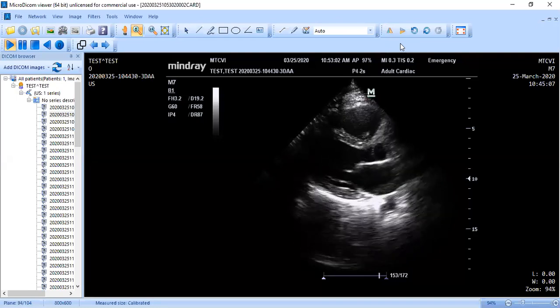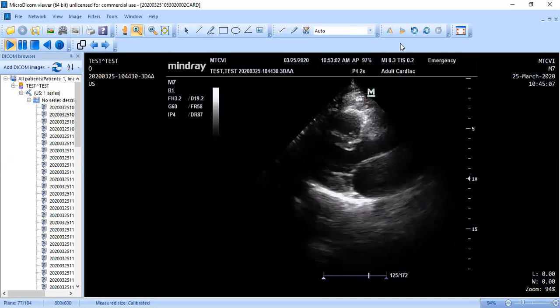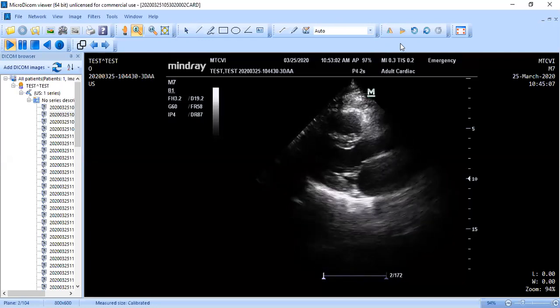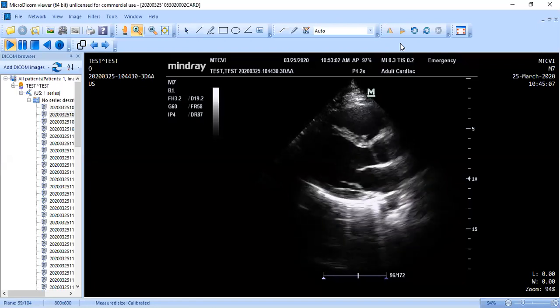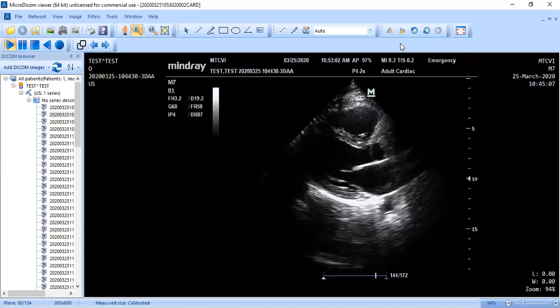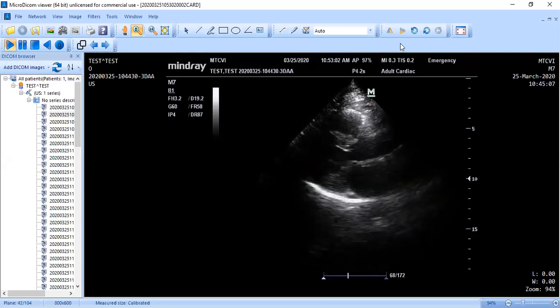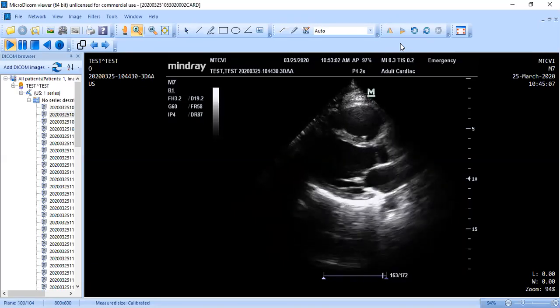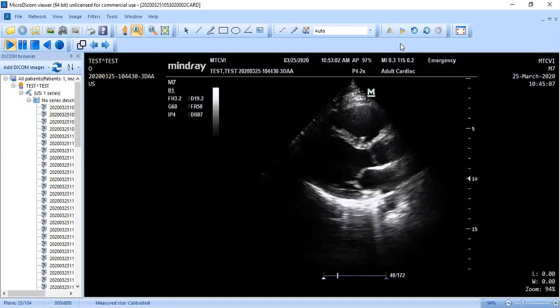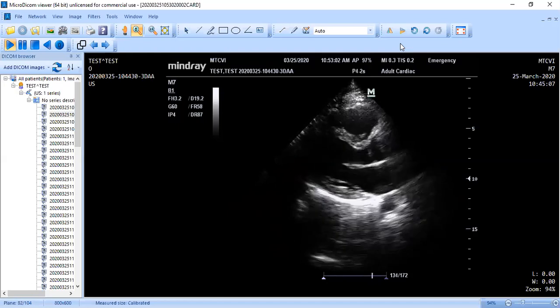I just wanted to come to you today as a follow up for the presentation that I did yesterday on going over the parasternal long axis protocol. Now I'm going to go through some live echo images that I did and point out some things to you. Hopefully this will help some of those things in the book make more sense, so you can put that to real life images that we're going to see each and every day.